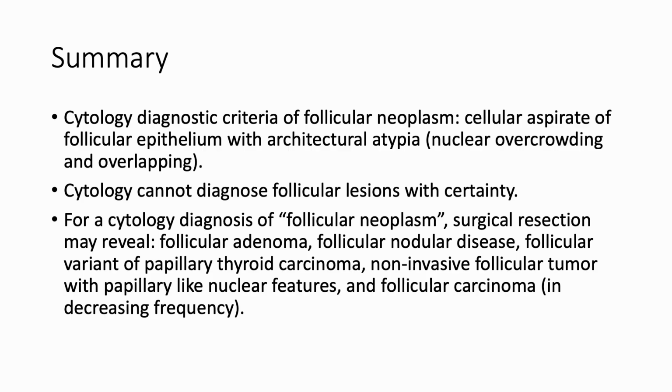To wrap up, cytologic criteria for follicular neoplasm include a cellular aspirate composed predominantly of follicular epithelium with architectural atypia. The architectural atypia can have different patterns, but the fundamental feature is nuclear overcrowding and overlapping. The background has minimal colloid and cystic changes.